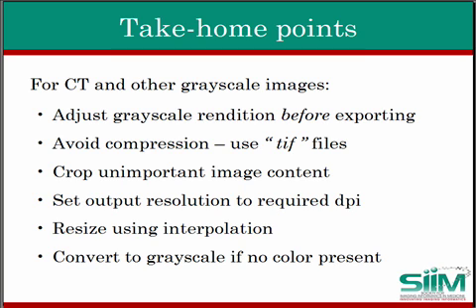Adjust resolution to the required dots per inch. Resize with interpolation to the width in inches or centimeters as specified by the journal. Finally, convert to grayscale output if no color is present before saving the file to disk. You are done with producing your journal quality figure. Congratulations.